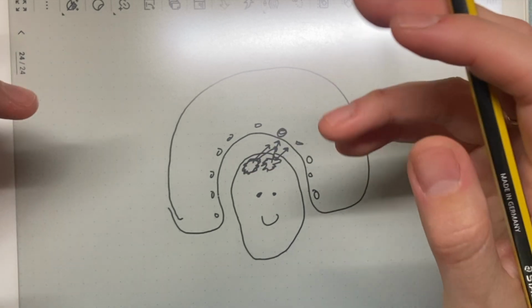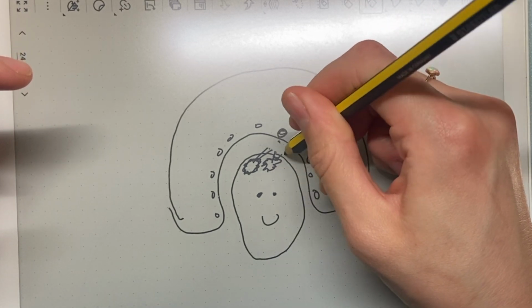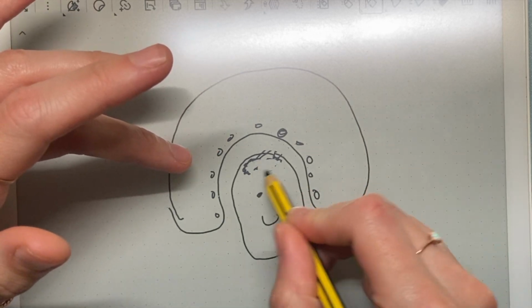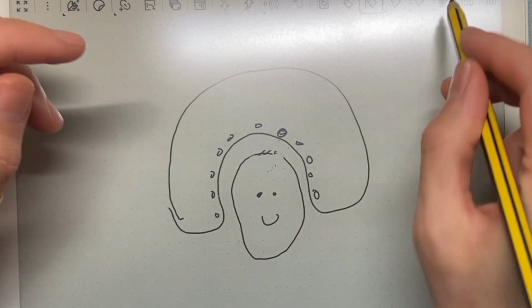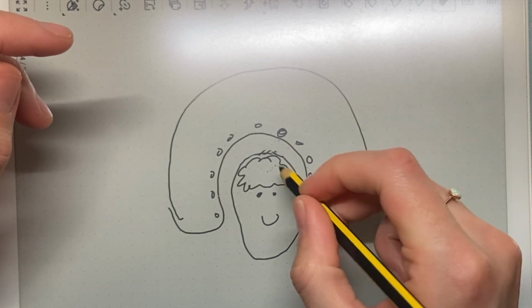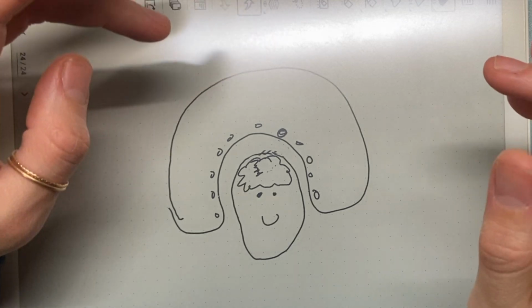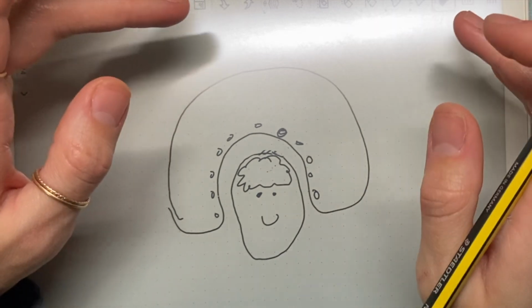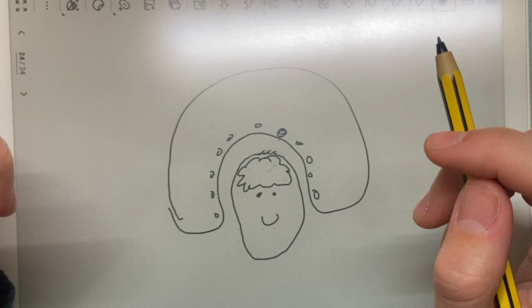And that's where the term source space comes in. So instead of looking at the activity at each sensor, we can look at the activity in the brain. And we can do this either through looking at it across the surface of the brain or looking at it volumetrically. So in order to move from sensor space to source space, we use something called the inverse solution.